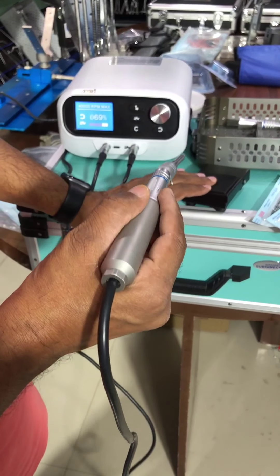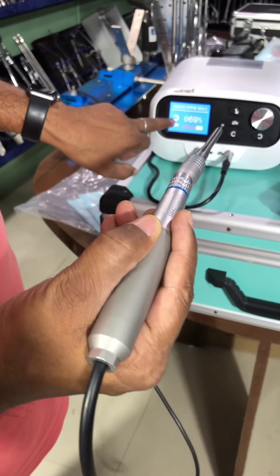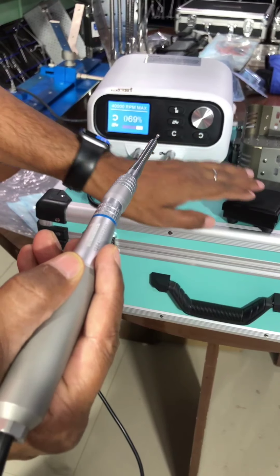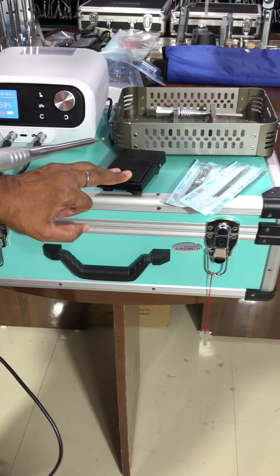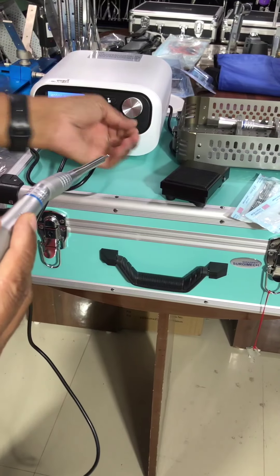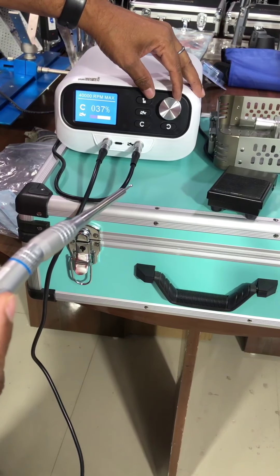Let's press this. This is rotation — this is reverse, and now this is forward. We can fix the RPM from here. Now 69%. You can put RPM — you can go less: 40, 50, whatever you want. You can set it.